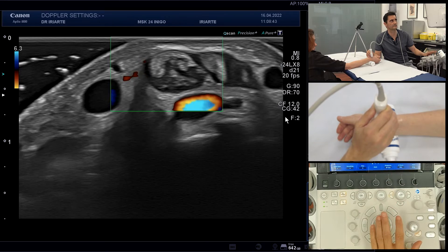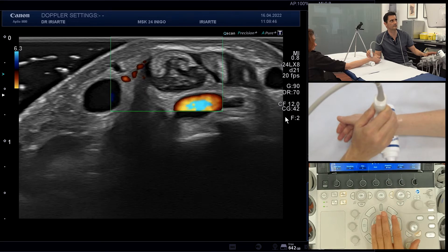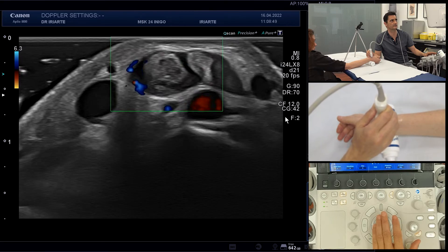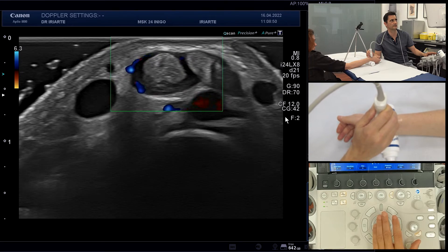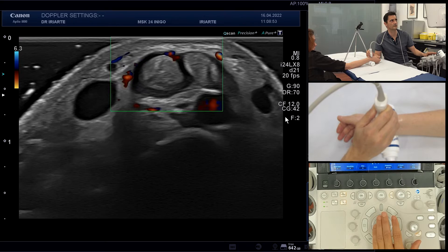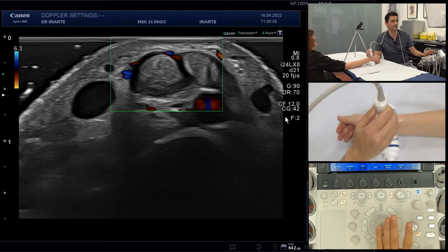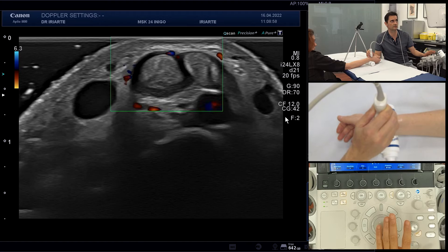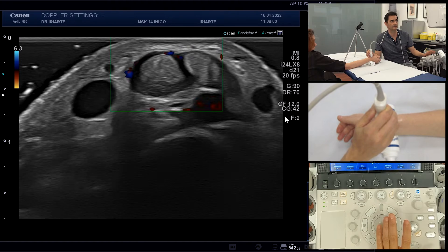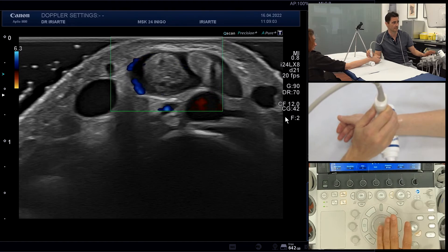Here there are no artifacts and we have a good view of the vessels. So PRF and gain are the two main parameters you want to adjust when you use Doppler.